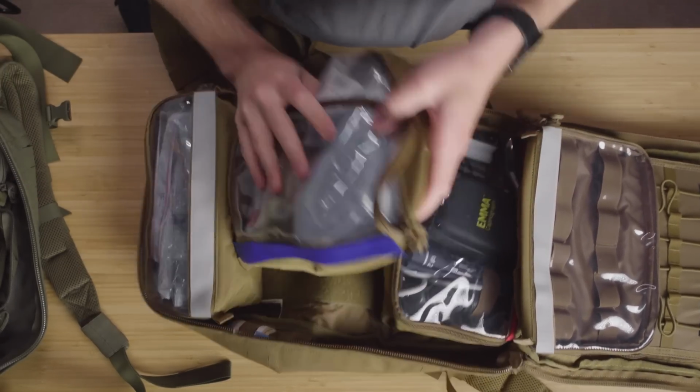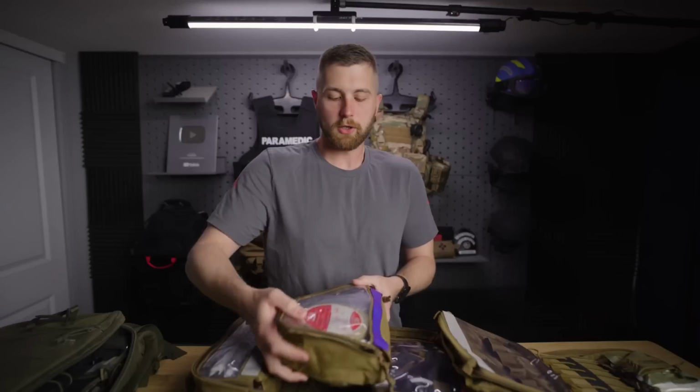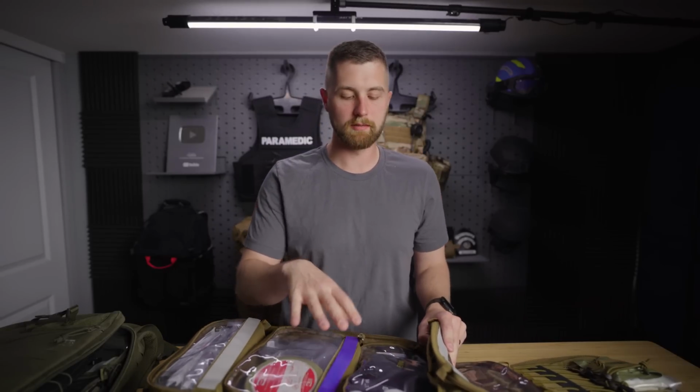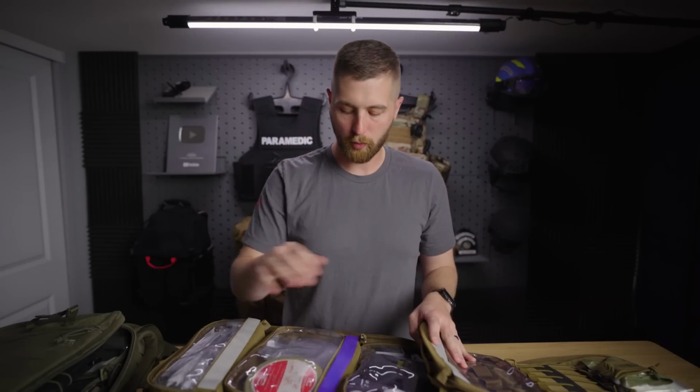They have your bungee loop retainers, and I have this packed to the brim, so apologies, I'll put up some B-roll and you can see what's on the inside there. So those are all gonna sit right in there, and it's modular. Like what I'm planning to do with this one is my diagnostic kit. I don't have enough money to get seconds of everything in here, so I'm gonna share this with my SAR pack. I'm gonna rip it out, put it in there. I really like the ability to do that in a hurry. I don't have to MOLLE anything. It pops right out with Velcro, and then I can throw it right back in.